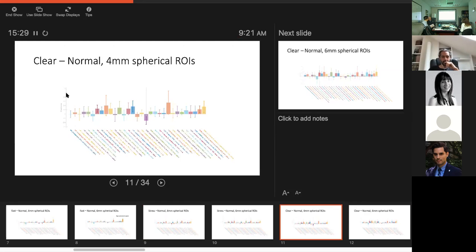It would be interesting, Alfonso, to come up with some way to use the FreeSurfer ROIs as an input to some system, and then go in and try to find the subcomponents, rather than just a straight-up probabilistic analysis. I'm not sure I understood what sort of transformations you're thinking about.